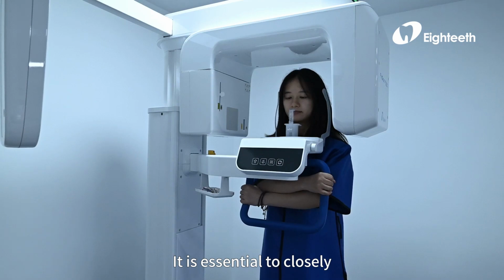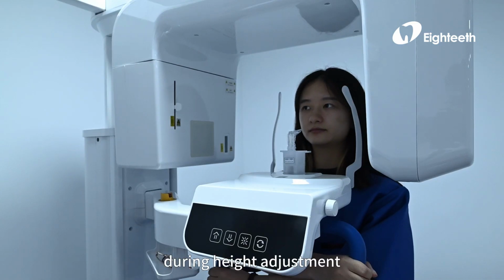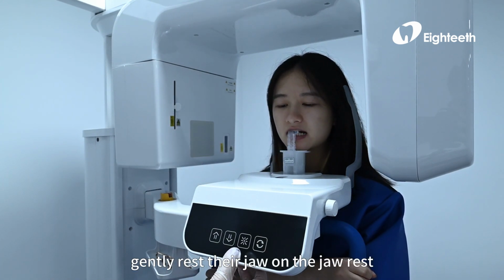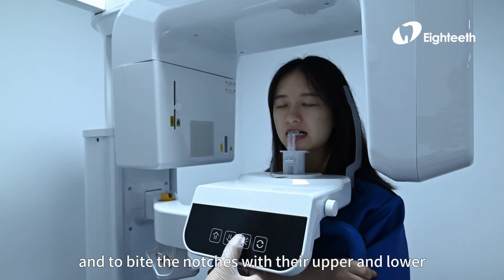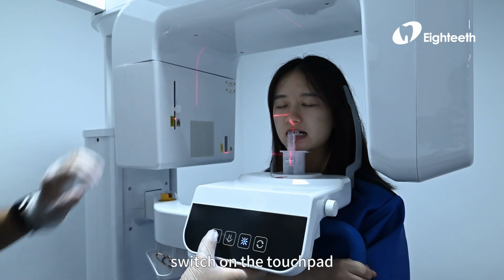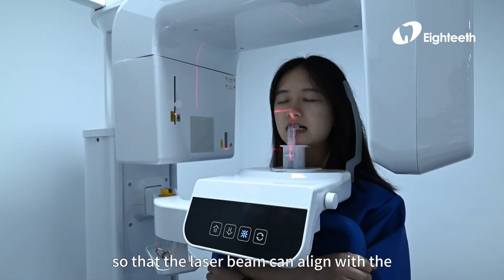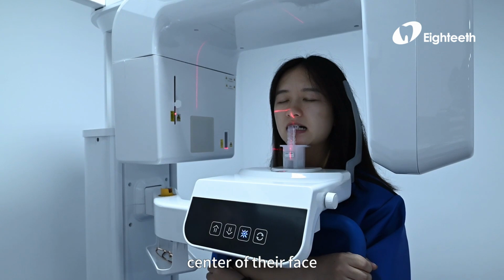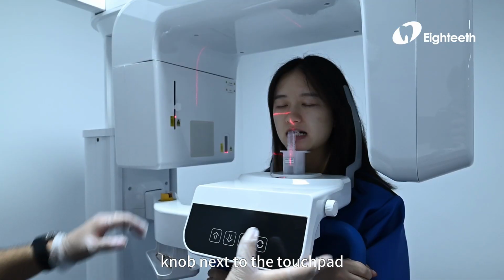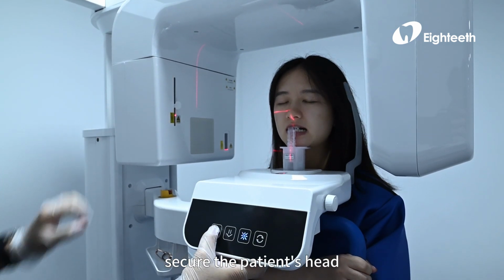It is essential to closely observe the movement of both the patient and the CBCT during height adjustment. Ask the patient to gently rest their jaw on the jaw rest, and to bite the notches with their upper and lower central incisors. Turn on the laser positioning light switch on the touchpad. Guide the patient to keep their head upright so that the laser beam can align with the center of their face. After adjusting the position, rotate the adjustment knob next to the touchpad to adjust the temple area head support and secure the patient's head.